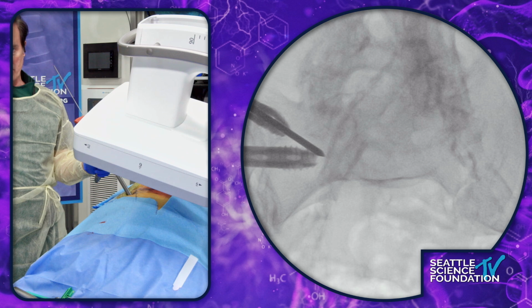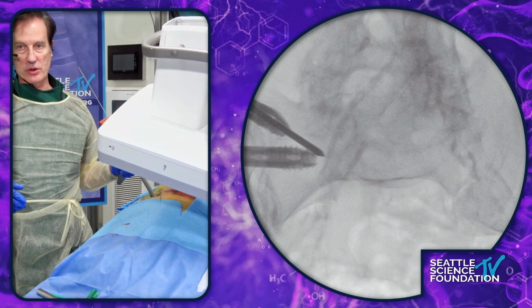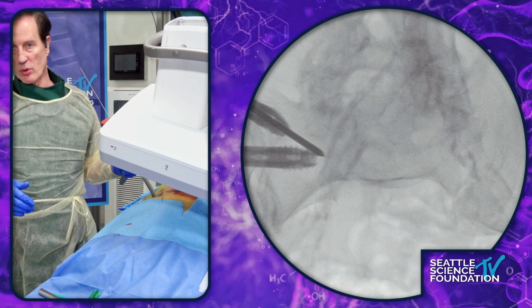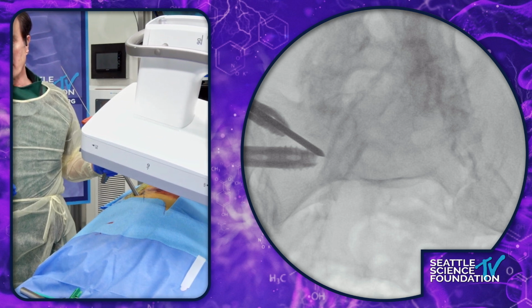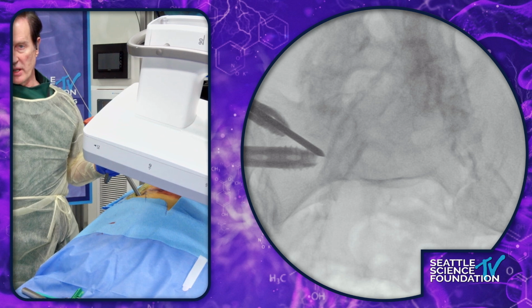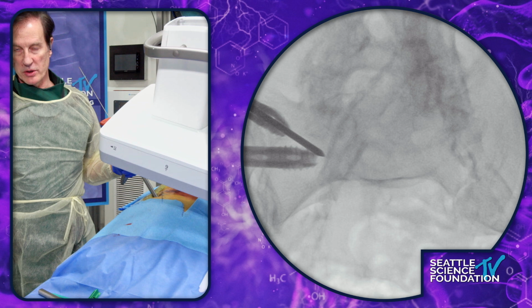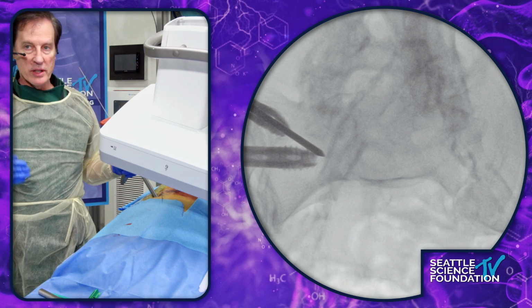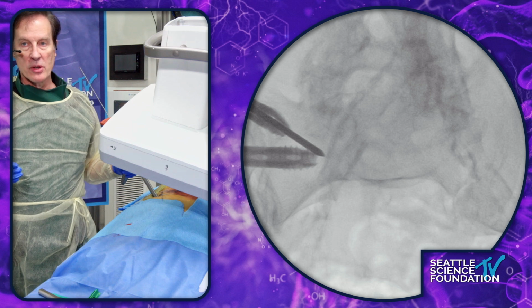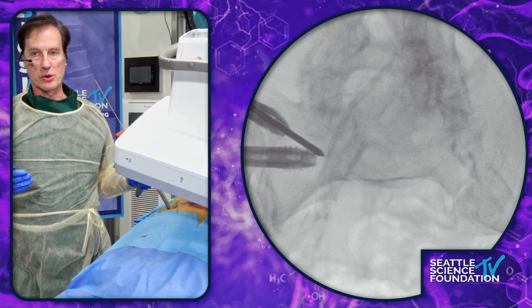But what you want to have is a situation like this, and this is a contralateral pelvic inlet view. This is a really nice view. So we're right at the posterior margin of the ilium. Ideally, we'd want the screw to come to the end of the Steinmann pin, and I've stopped short because of the obstruction, but that's where the appropriately sized screw would be. So in this case, a 55, perhaps a 60 millimeter screw would be appropriate, but that's the posterolateral technique.